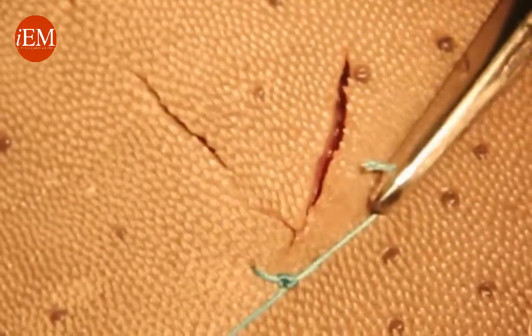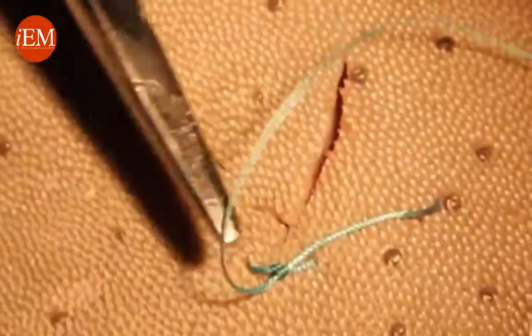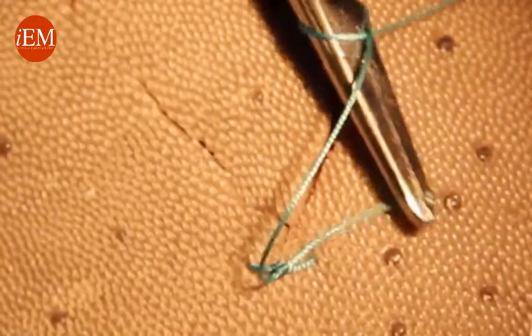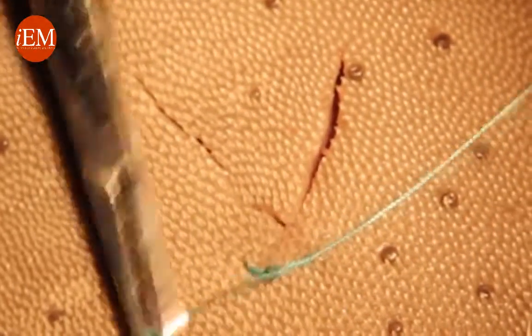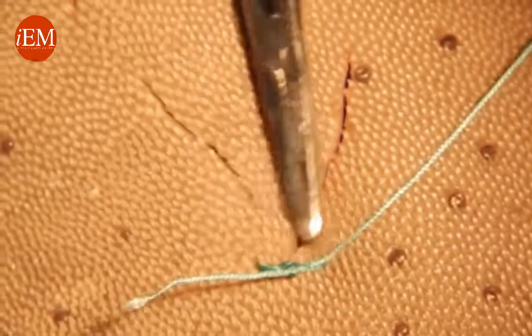Make a square knot. Every time I have to come down flat, and now I have one corner stitch.